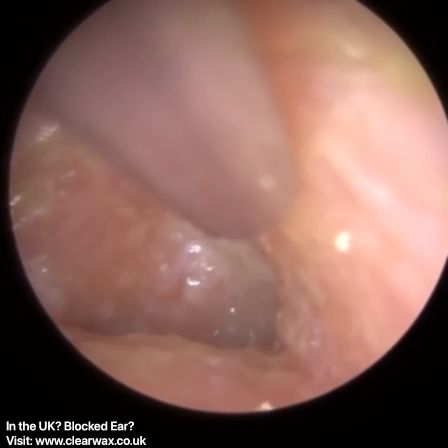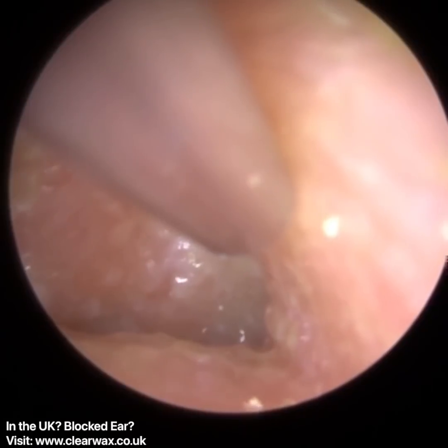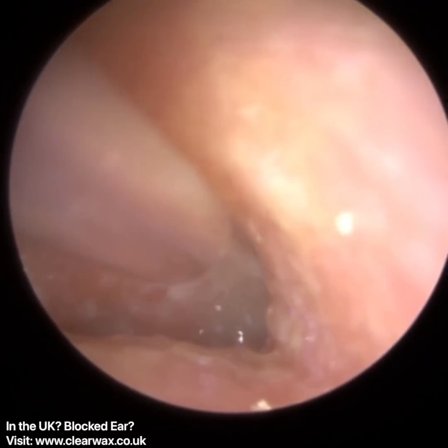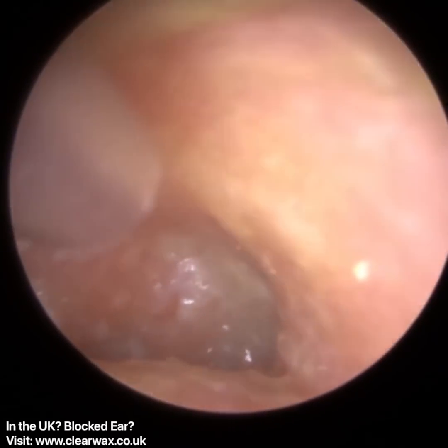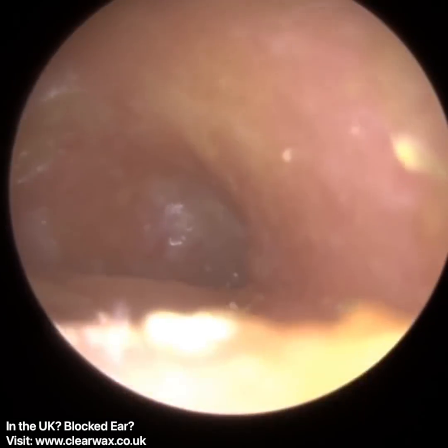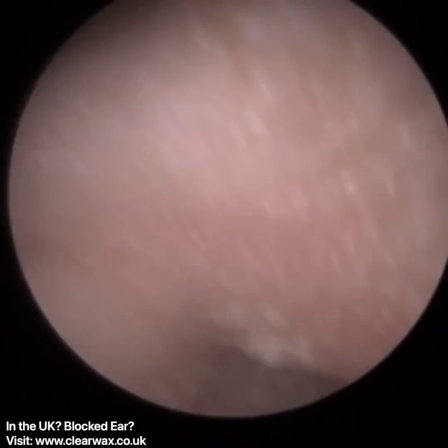And we're just gently hovering over the canal. Don't want to make any contact because that would be uncomfortable. So one of the symptoms of swimmer's ear infection is tenderness, swelling, pain in the ear. We don't want to add to that. The patient's already come here today with pain. As you can see, the entrance, as I mentioned right at the beginning, was inflamed.